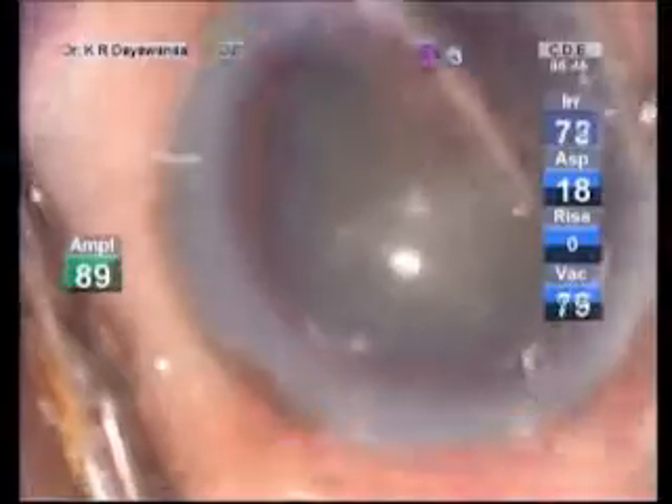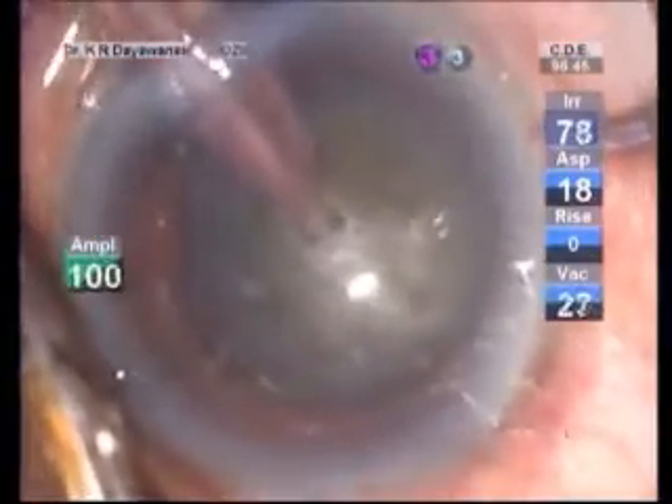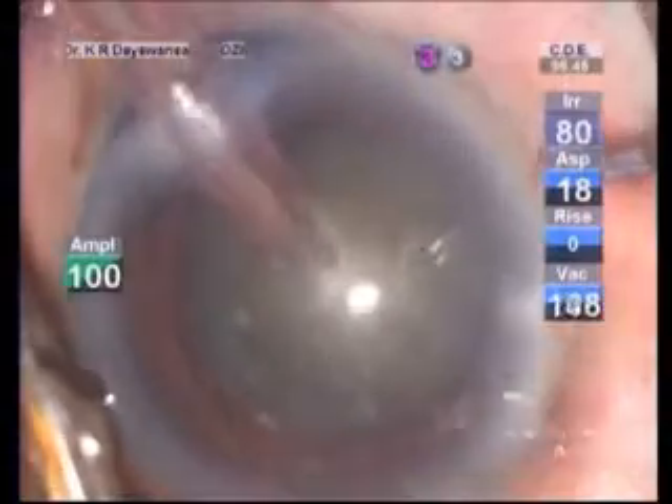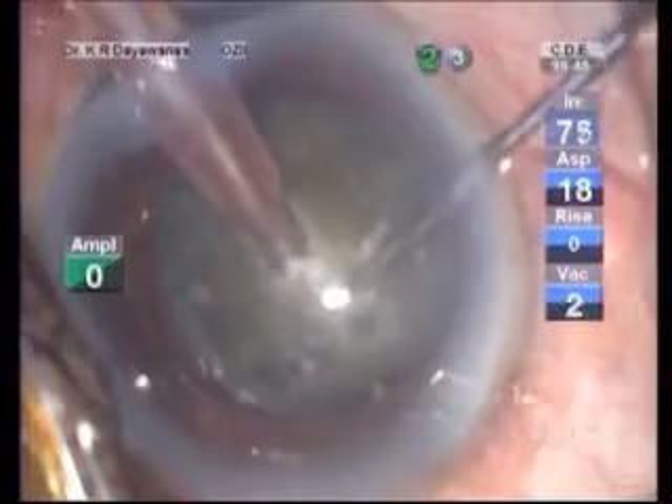Let's see how it works on the real eye. Once you remove the superficial cortical matter, this is the step to make a vertical hole and it should go up to 90% of the depth of the nucleus.